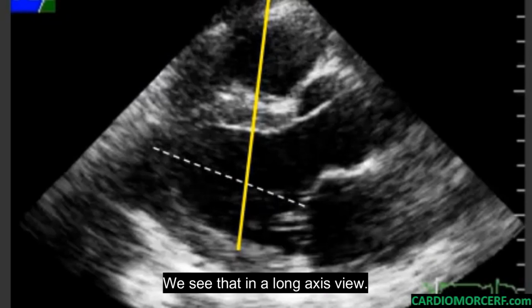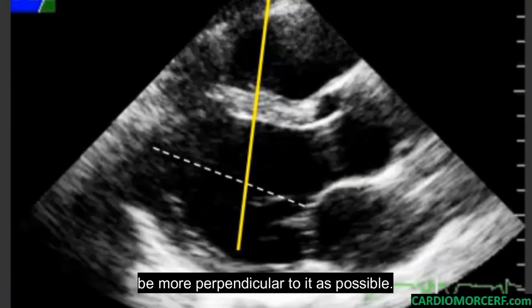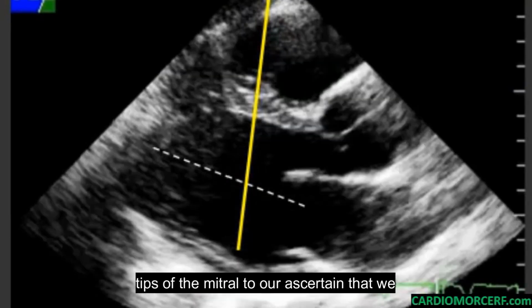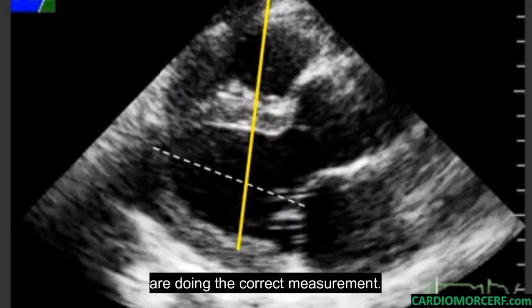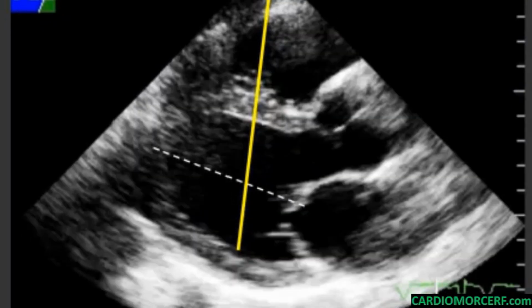We see that in a long axis view, we know where the long axis is and then try to be as perpendicular to it as possible. And we know the area of the chords and the tips of the mitral to ascertain that we are doing the correct measurement with the best angle and position possible.